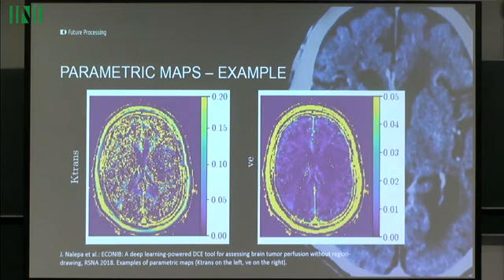Those values should be important, they should quantify the characteristics of the tumor. It differs for different tumors, for different stages. If we have dynamic imaging, we are interested in those two numbers, and we want to analyze those parts of the image. We may even compare with different parts of the brain which are healthy.